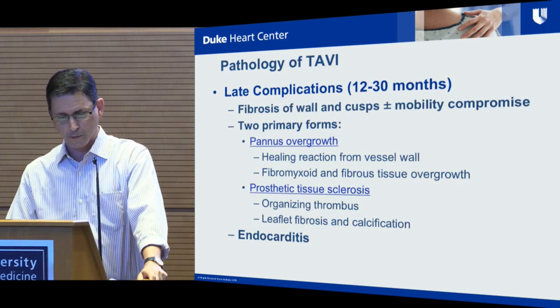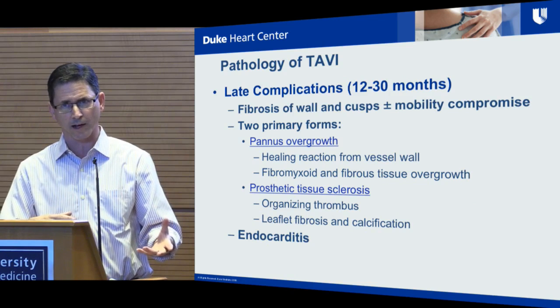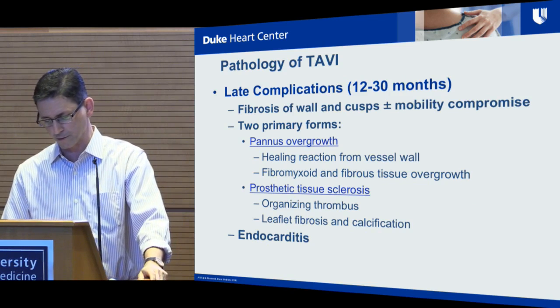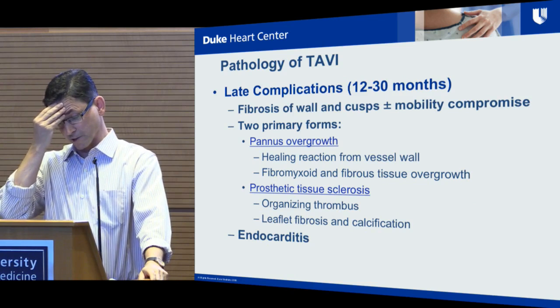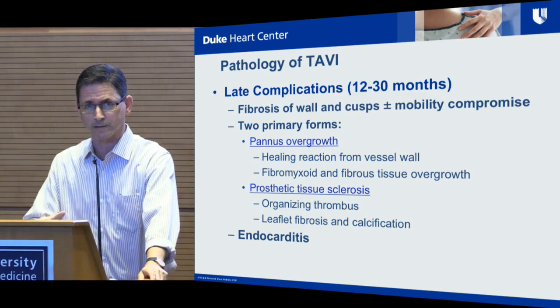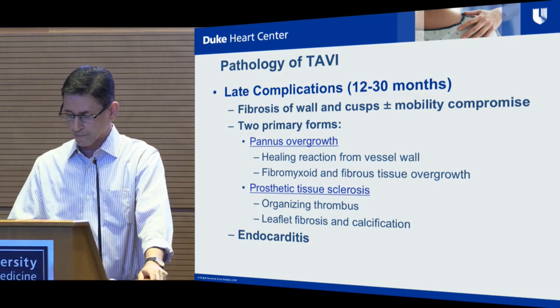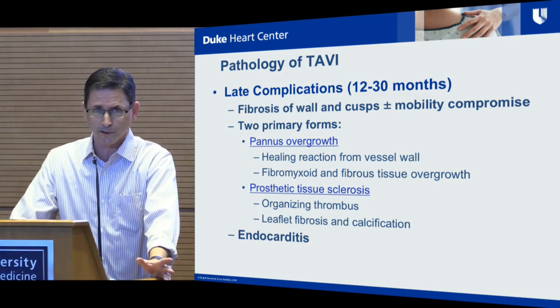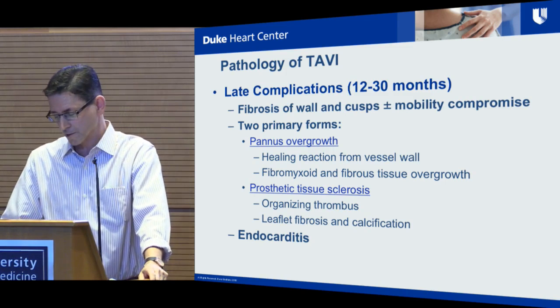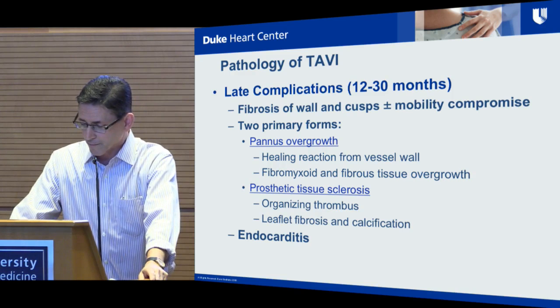And then late complications we look at, which is more what the response of the body to the valve does to the valve. And the valves are essentially stents, and stents are kind of like the Donald Trump of vascular medicine. So they promise to make the lumens great again, but in general, they're irritants, and the host must learn to tolerate them.